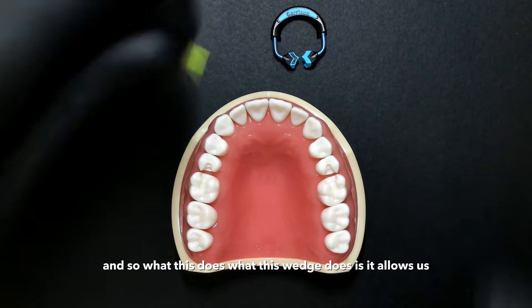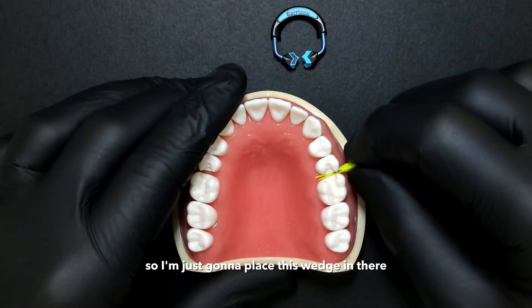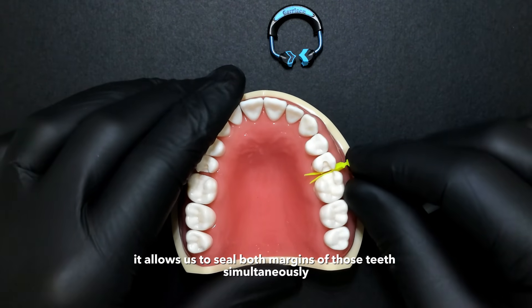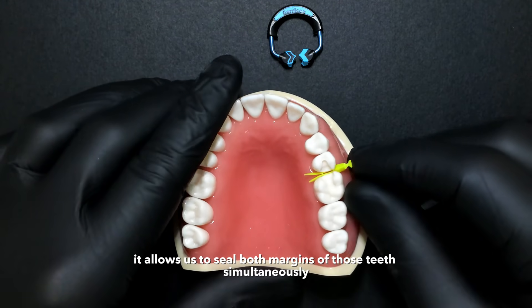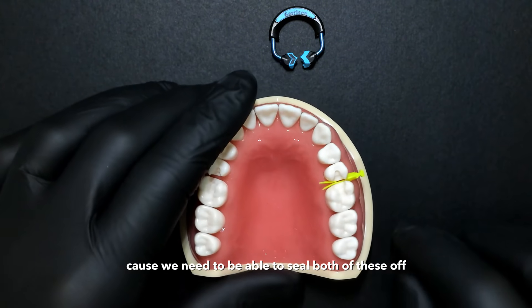What this wedge does — I'm just going to place this wedge in there — it allows us to seal both margins of those teeth simultaneously. That's a big deal when it comes to back-to-back restorations, because we need to be able to seal both of these off.